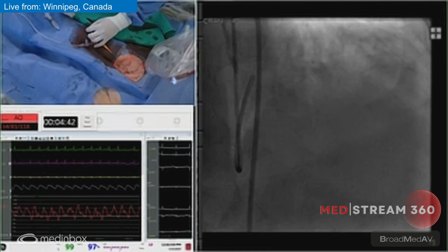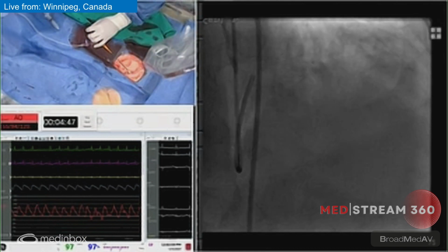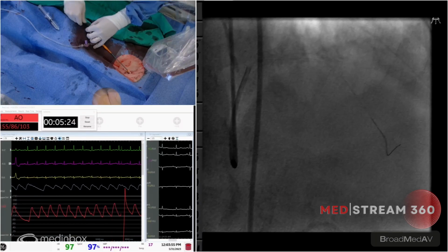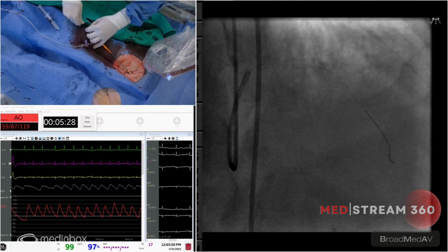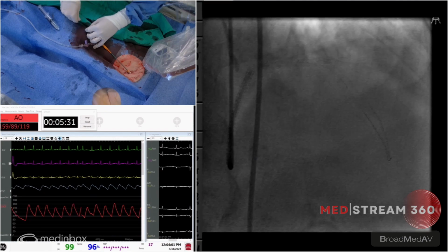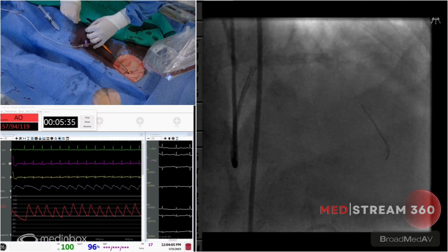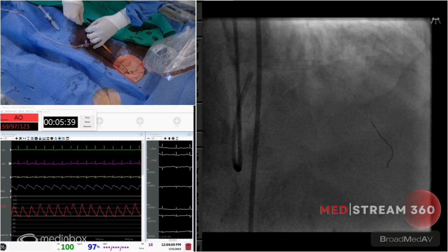So we're going to go with our BMW. Can I get a wet one, please? Perfect. So what do you think, Malik? Do we balloon first? See if we can get an OCT across, or just go primary with? I think you probably could try to get an OCT across first. If that doesn't go across, it'd be low threshold for ballooning. Don't want to modify it too much. It might throw you off with the interpretation of the OCT afterwards.